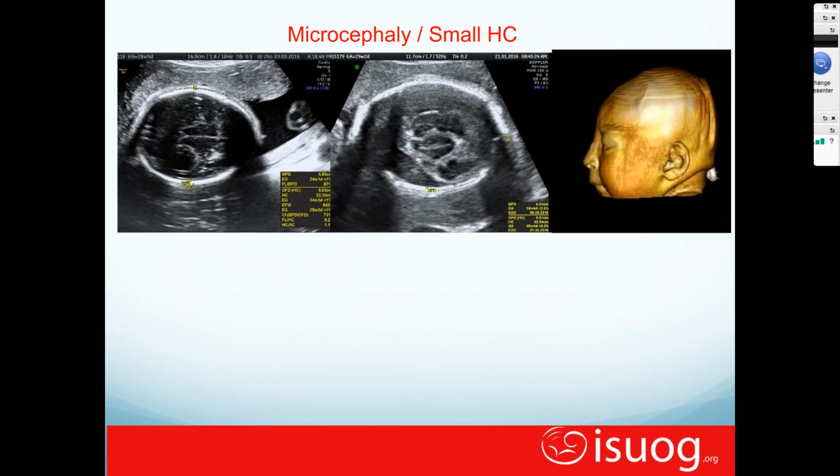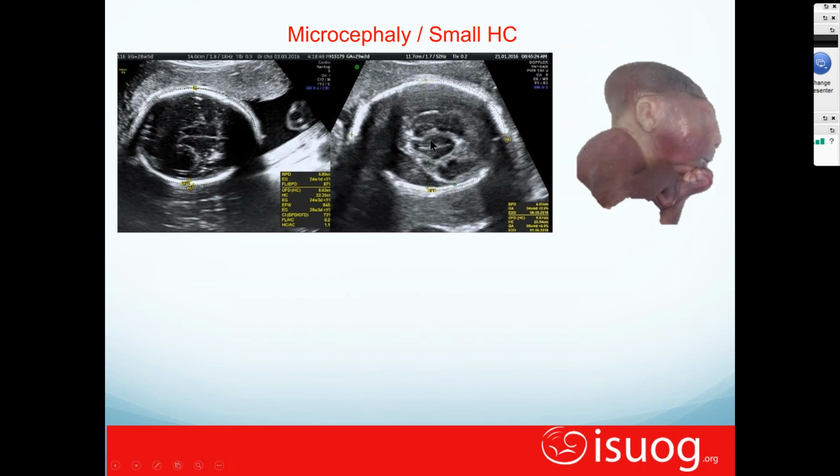Microcephaly. Certainly we all can measure the head. Certainly we all could recognize what the shape looks like on the fontanelle of the forehead, the frontal bones. We can look at suture lines and see if the sutures are prematurely closed and the chance that they may be microcephalic. But here, these are small heads and small head sizes that you can see here. This is a head circumference that's less than the first percentile. These are things that we need to think about and recognize in a 28-week fetus and a 29-week fetus, let alone in the reconstructed head that you see here.